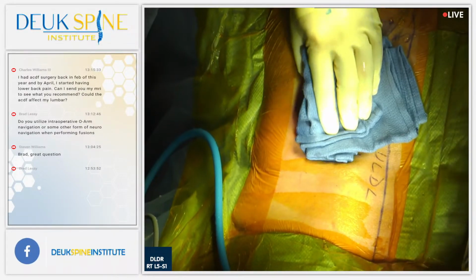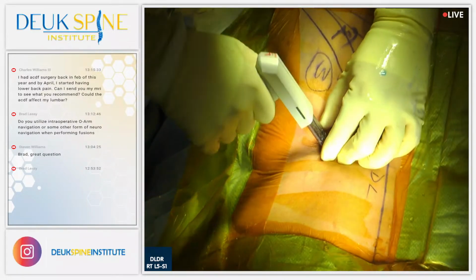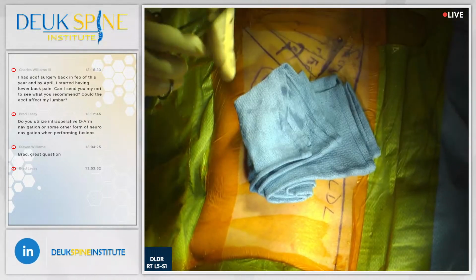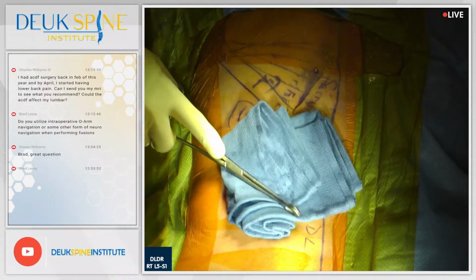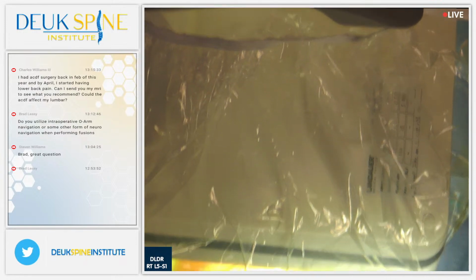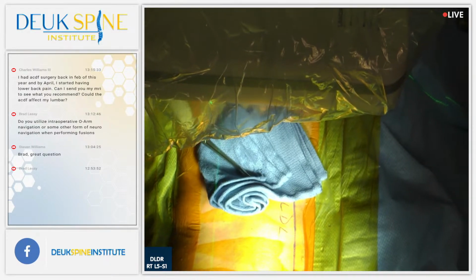You don't need the O-arm. It doesn't add anything. I mean, if you're not a well-trained spine surgeon, then you need the O-arm. But if you're a really well-trained spine surgeon, you do not need the O-arm. And if you're a spine surgeon and you want to learn how to do spine surgery like fusions without the O-arm, come see me and I'll teach you. There's no need for the O-arm. There's no need for robots in spine surgery. The best spine surgery is done without the O-arm. The best spine surgery is done without robots. There's some herniation there if you want to get it.